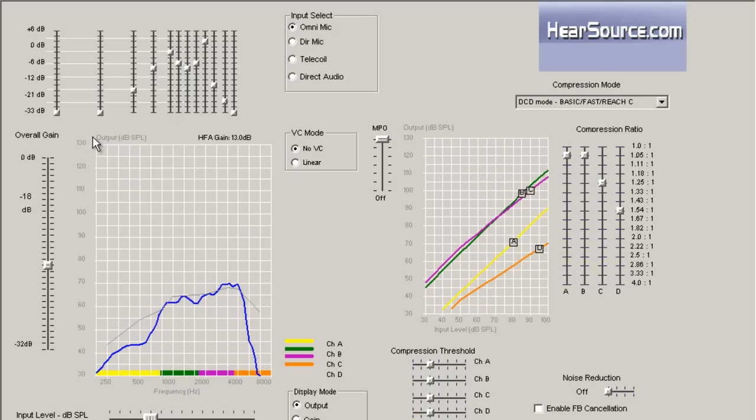And so by turning those types of frequencies down, that will help your own voice sound more natural to you. It will get rid of that echoing, and if you are hearing too much of the background noise, that will help eliminate some of that as well, help filter that out.